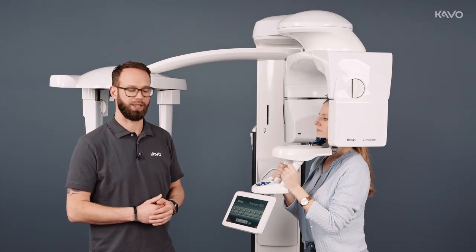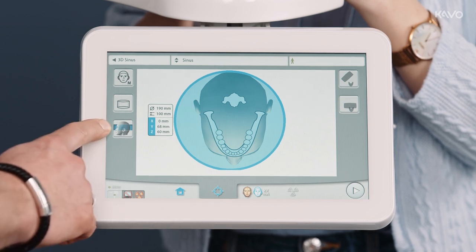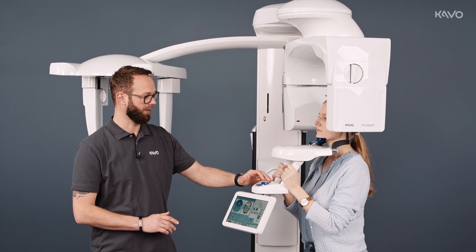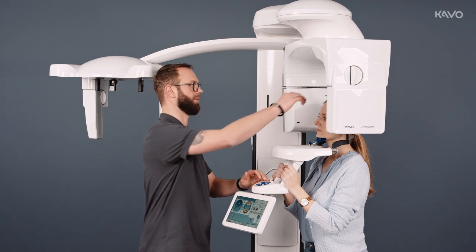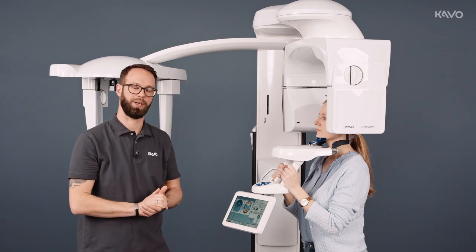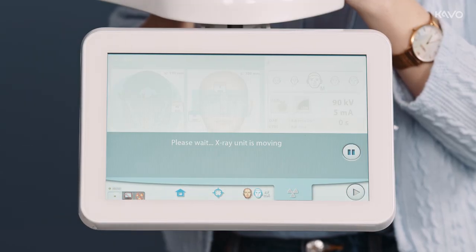If we want to do sinus imaging, we select our ear, nose and throat programs and go to Sinus. Here we can change the height of the volume, go to the positioning level, and use our arrow keys to change the height of the volume. We align the head in the mid-sagittal plane and close the head holders. Since we are at the maximum diameter of 19 cm again, lateral positioning isn't necessary. Now we can switch straight to image-ready mode and proceed with the imaging.